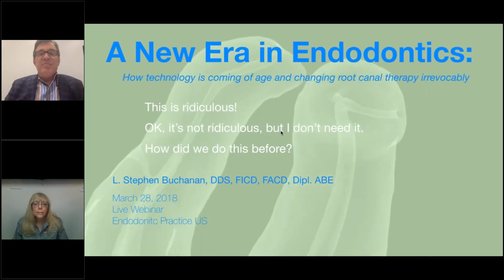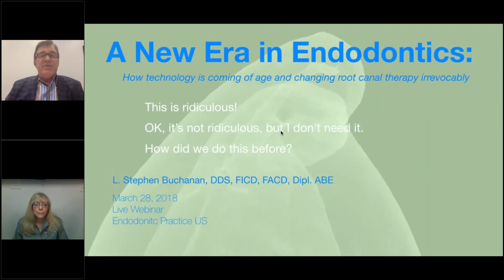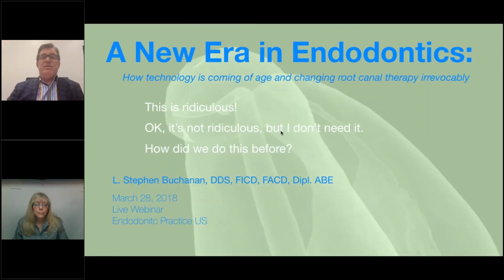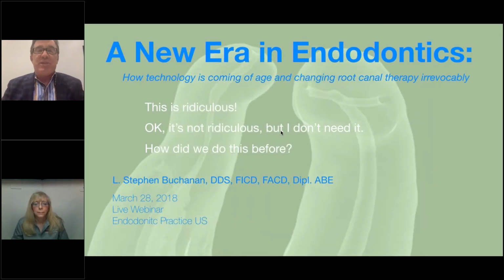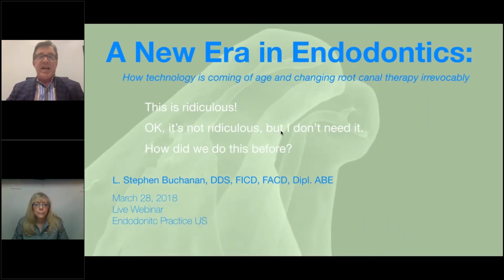We always get all hung up on the obturation, and we want to show this beautiful look. But if you kill all the bacteria in every root canal you ever treated, you could put glass ionomer at the orifice levels, not fill any of the root canals, and most of them would heal. So we see the evidence visually with the fill, but the most important thing is what precedes that. The only reason you'll ever see a lateral canal filled is because somebody cleaned it out.